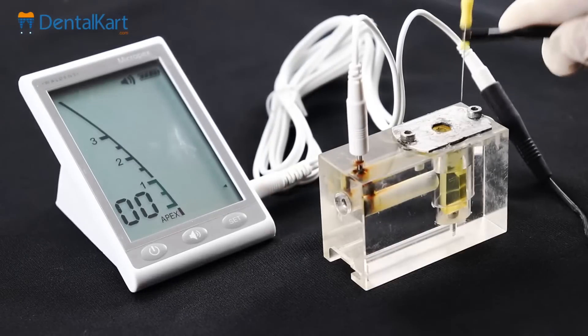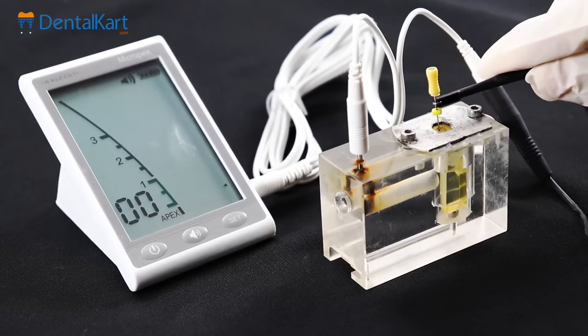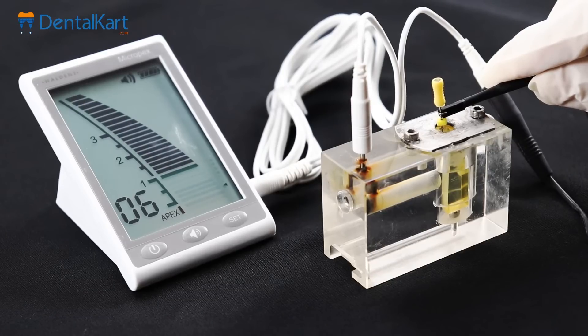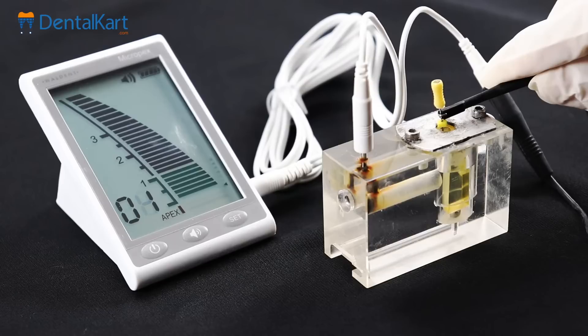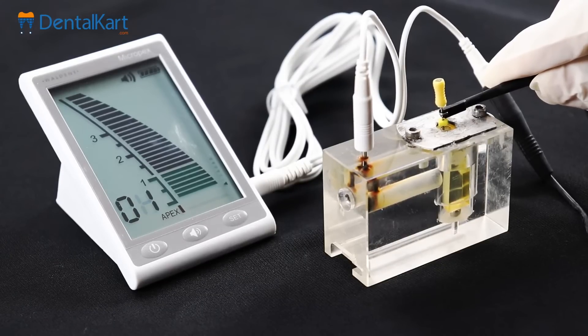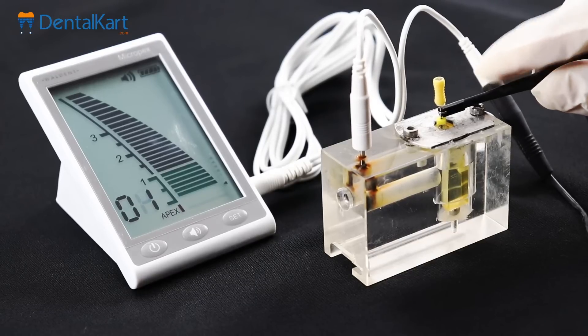Begin by inserting the endodontic file into the root canal. As the file enters the canal, the apex locator activates, and on the display you will see a series of bars. These bars signify the file's progress within the root canal. An accompanying audio signal chimes with intermittent beeps as you make progress with the file, providing visual and auditory cues for precise measurements.